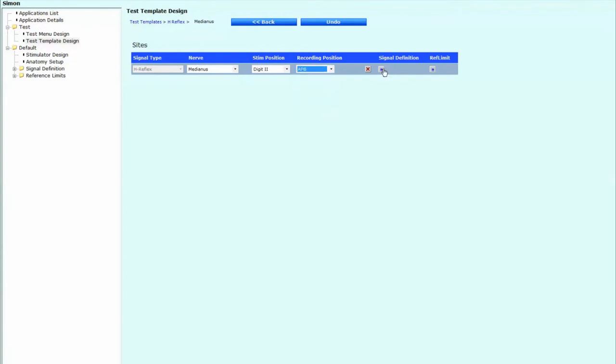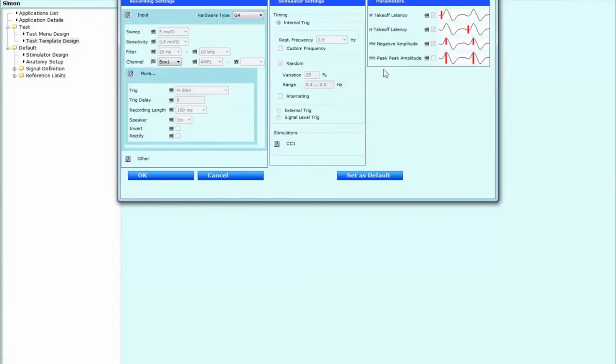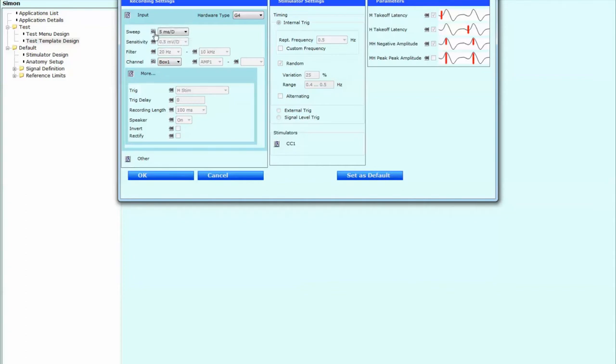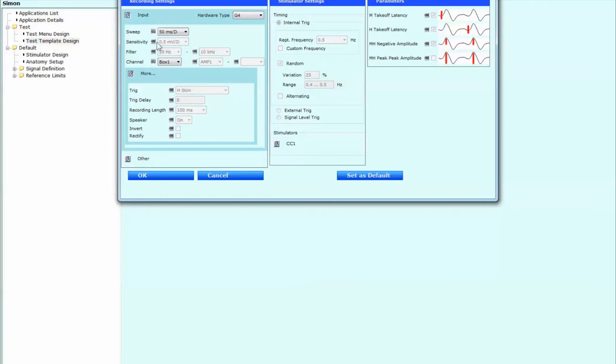And now we're going to go to the signal definition. And what we have to do over here is we have to change a number of these settings. So the first one we're going to change is the sweep speed. So we're going to see a little linkage sign over here. It kind of locks the system. So you have to sort of click on it so you can unlock it. So switch that to 50 milliseconds per division.